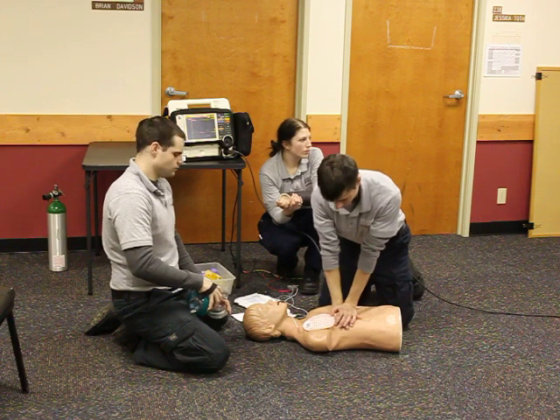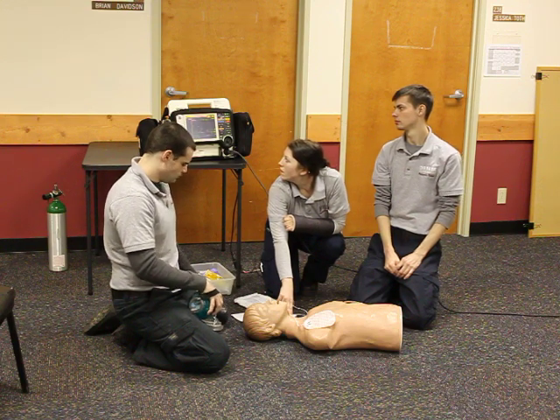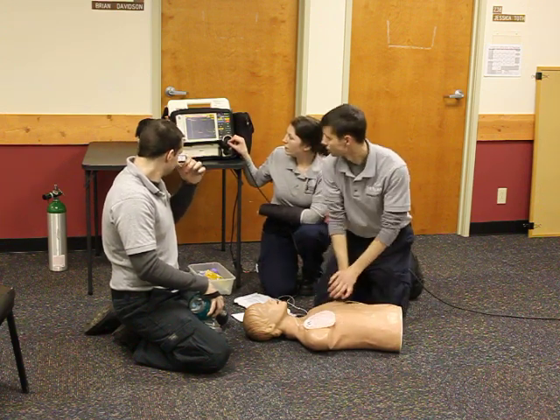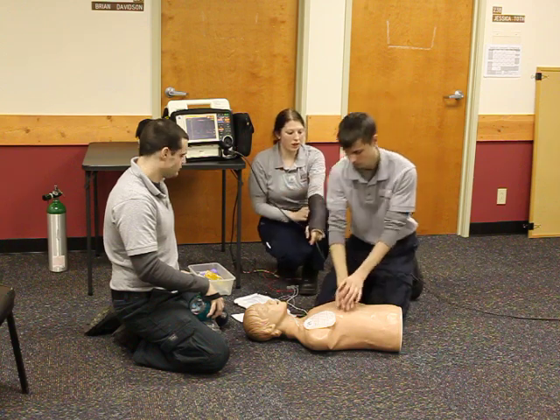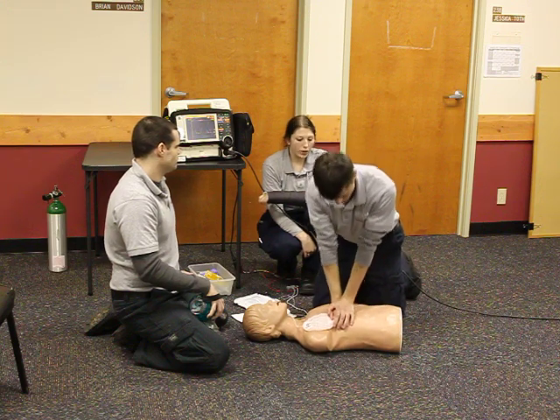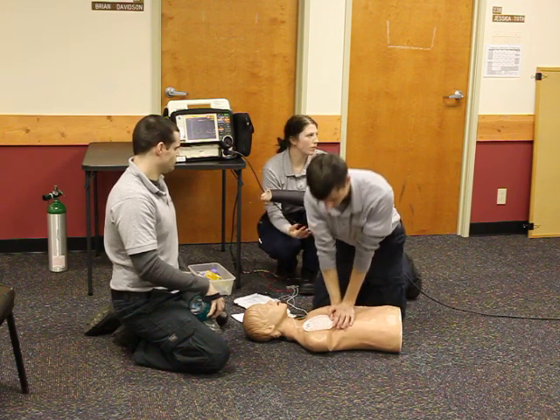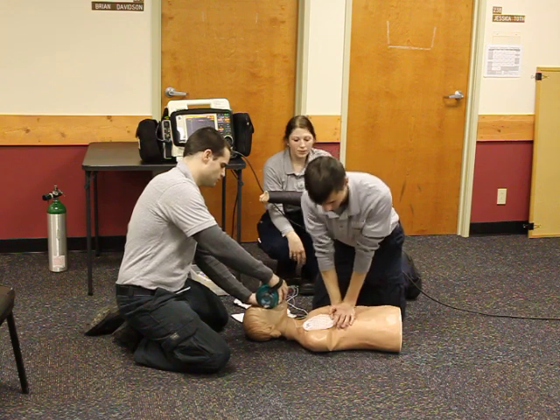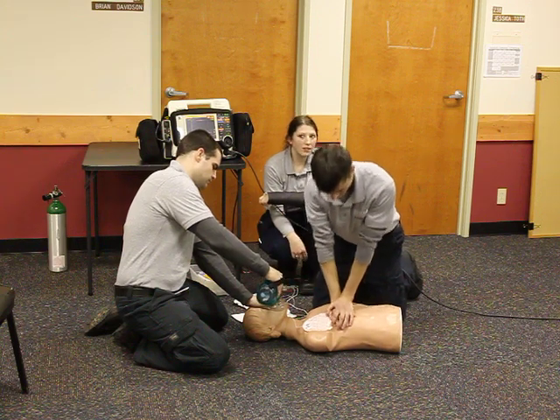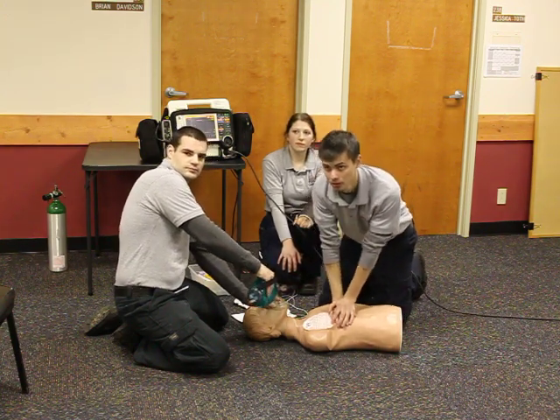After 2 minutes of CPR, we're going to do another pulse and rhythm check. Feel for a pulse and look at the monitor. Do I have a pulse? No pulse. I note asystole, so I'm going to check it in another lead. We're going to continue CPR. If it stays in asystole, we're going to deliver 1 milligram epinephrine every 3 to 5 minutes. Continue with CPR, or now that we have intubated, we're going to ventilate every 5 to 6 seconds. We're going to transport to the hospital. After 10 minutes, consider sodium bicarb. This concludes your Paramedic National Registry Dynamic Cardiology section.